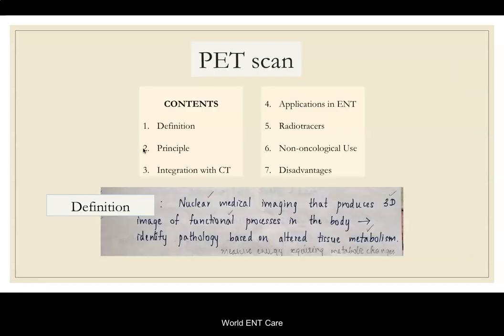Next, we are moving on to PET scan. We shall be discussing this under definition, principle, PET CT integration, ENT applications, various radiotracers, non-oncological use, and disadvantages.